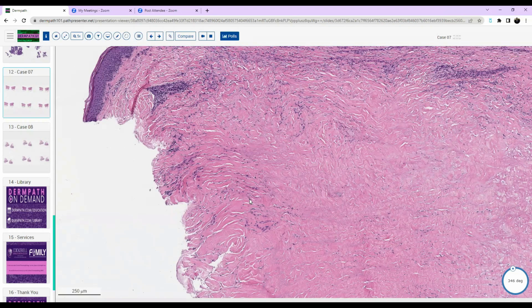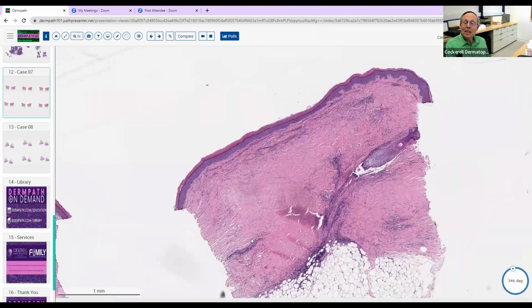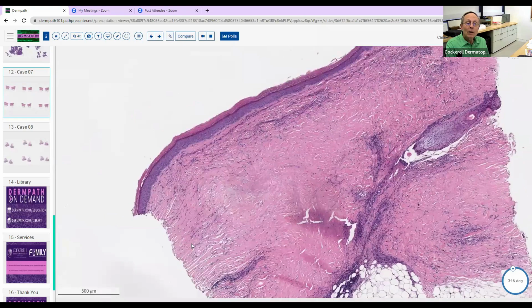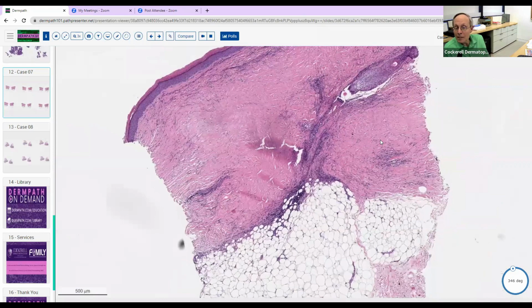I would think of sarcoid. Well, sarcoid gives you sarcoidal granulomatous dermatitis. This is palisaded. So remember the three main palisaded granulomatous dermatitides: granuloma annulare, rheumatoid nodule, and necrobiosis lipoidica. The tiramisu layers. This is an example of necrobiosis lipoidica in a relatively late stage. Here's the palisaded granulomatous dermatitis over here, and here it is over here. And then we've got lots of degenerated thick sclerotic collagen, which is what you see in the latest stage of NLD. So this is a beautiful example.